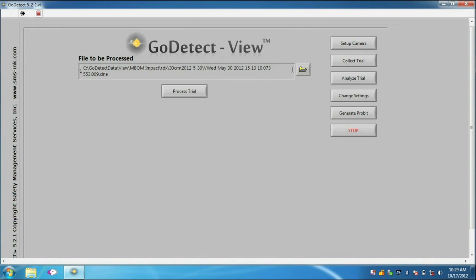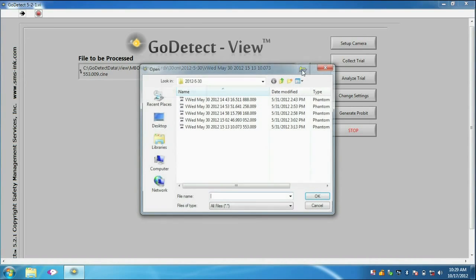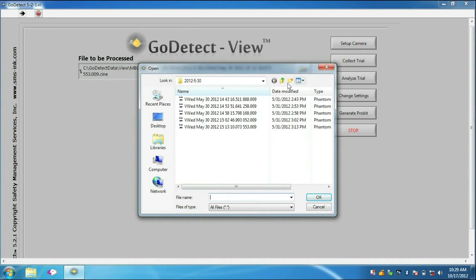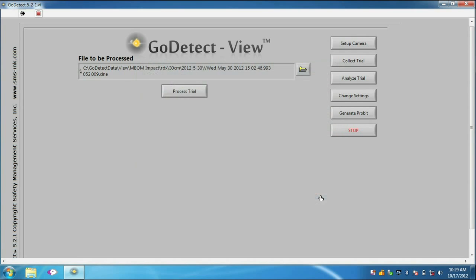The software also generates the necessary storage folders to systematically file the high-speed video for future retrieval or reanalysis.